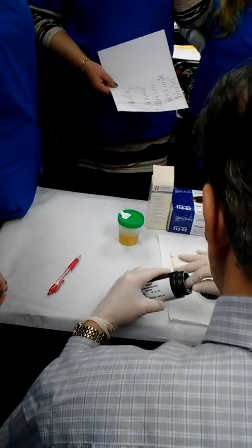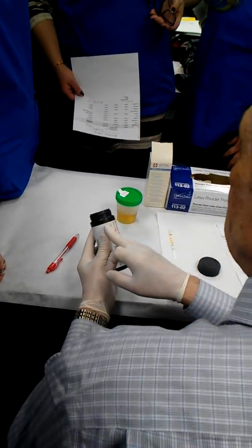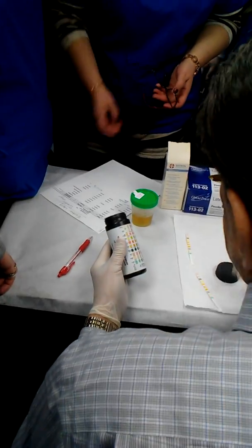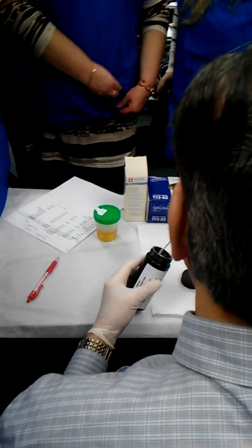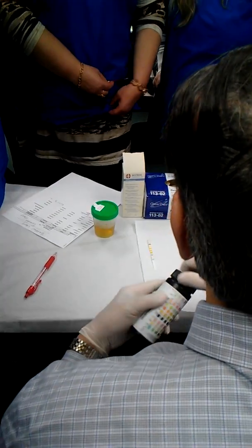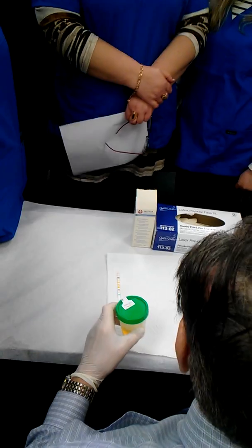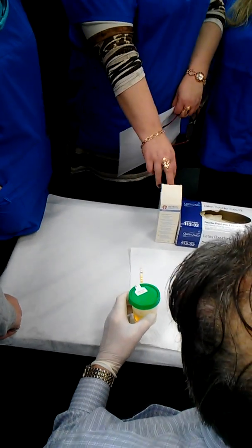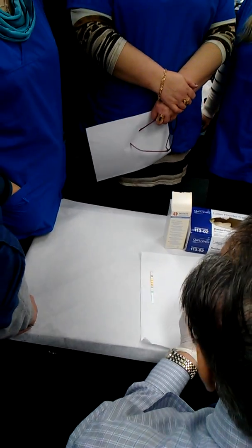Я знаю. Но мне не нравится, что он розовый колор. Тут не должно быть розового цвета. Ну ладно, почему-то розовый, не все розовые. Ну окей, ладно. Сейчас посмотрим, что получится. Николай, не волнуйтесь. Вот, все может быть. Поэтому, может, ну тут написано июль 17. No, it's okay. Sometimes it could be not good color.